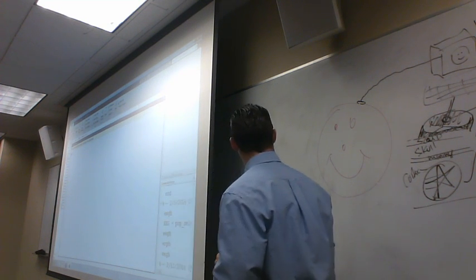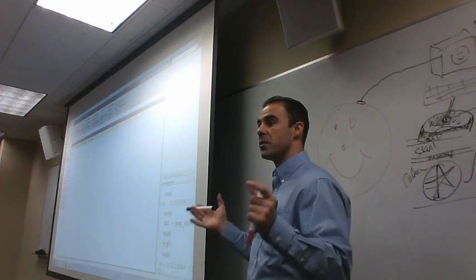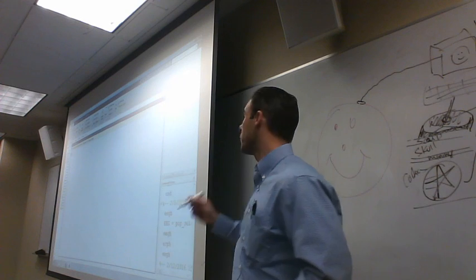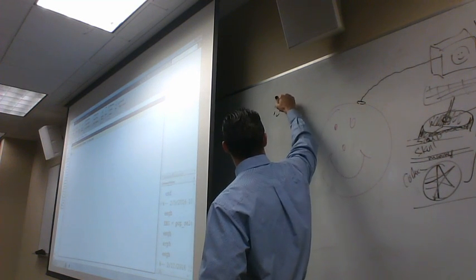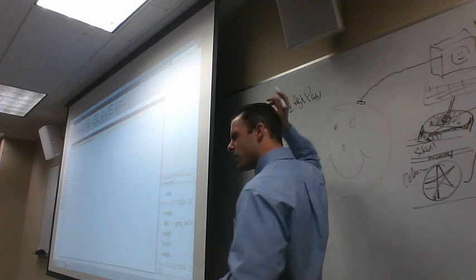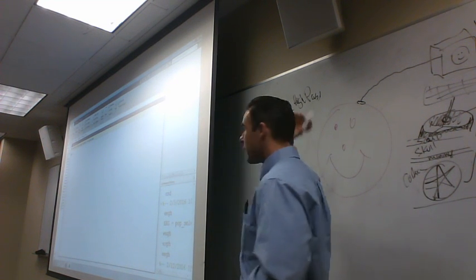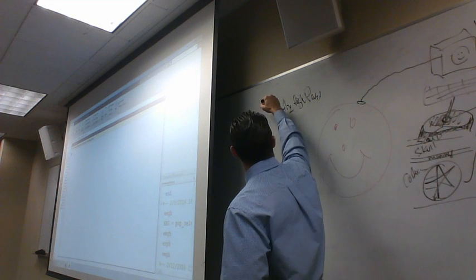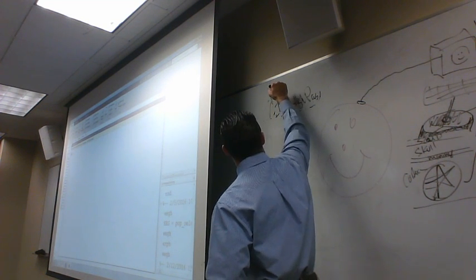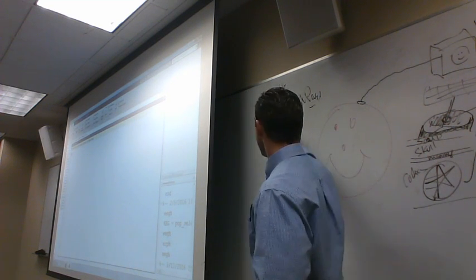So we got rid of our series of events, but later on when you have ERPs, right before you make your figures, you're going to apply what's called a low-pass filter. So we've already done the high-pass filter, let's say 0.1 hertz. And what was a high-pass filter again? Can you guys remind me? What is it allowed to go through? Higher frequencies. Anything higher than this 0.1 hertz. So if it crosses this threshold, anything above here is okay. Anything below here gets cut off.